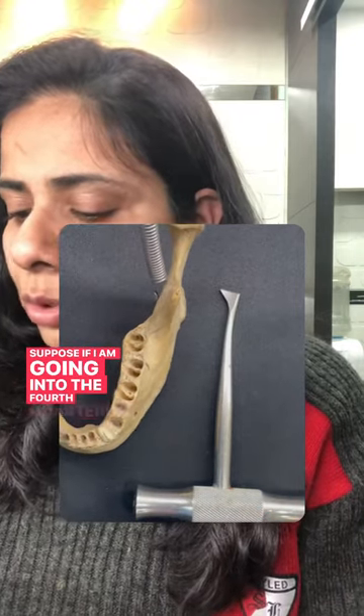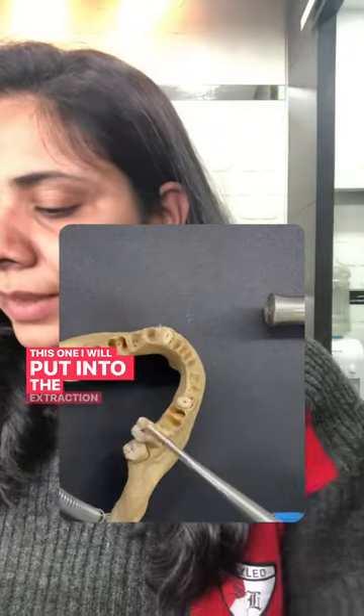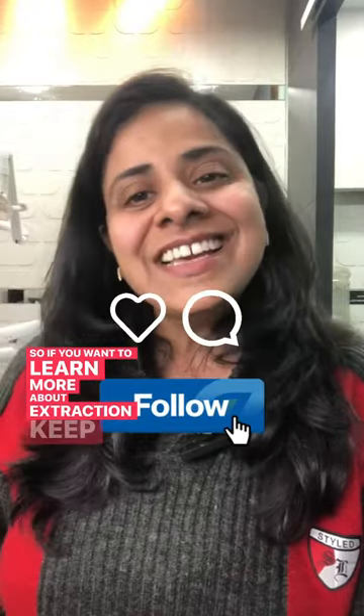Suppose you are going into the fourth quadrant — this is the one you will put into the extraction socket. If you want to learn more about extraction, please follow for more.